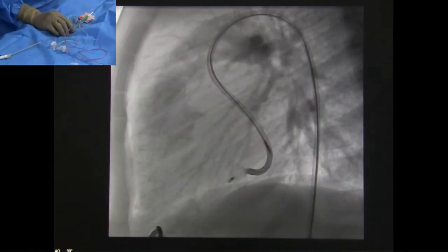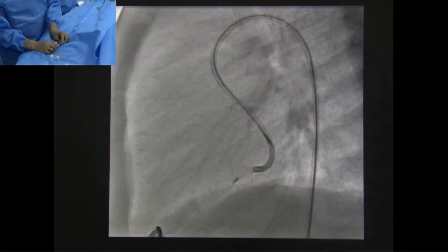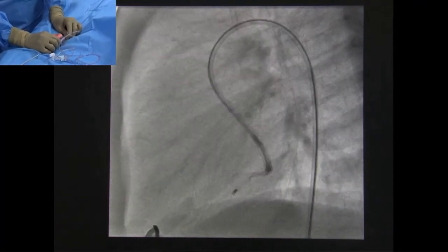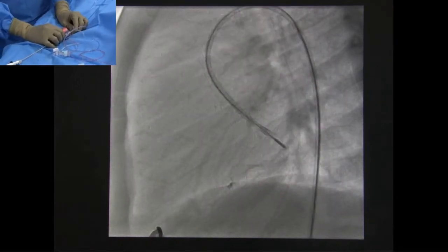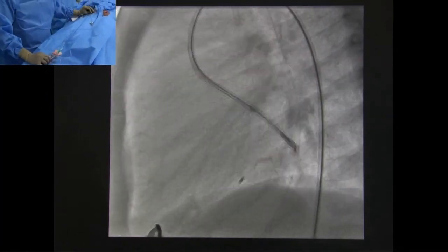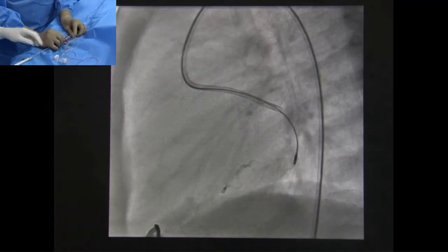I think you're in good position. So what do you feel? This angiogram, where we had the baseline angio, so that you know exactly where you are. You're deploying it, but go ahead. I'll just deploy a little bit here. I'll not pull anymore. The only concern I have is your retention disc on the other side may occlude the coronary because it's a long device and it's not forming. Yeah, I expected that. The device will not be formed because the device will adjust as per the requirement of the fistula track. Now can you do the angiogram here?